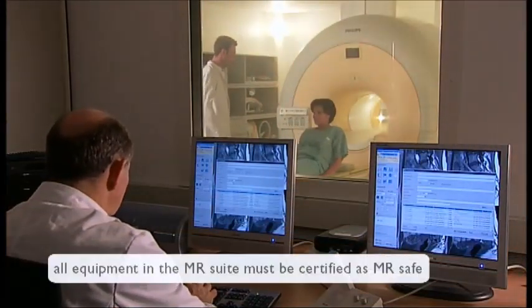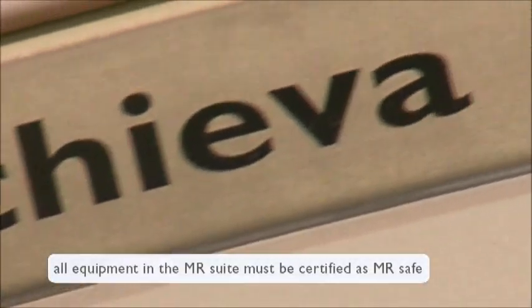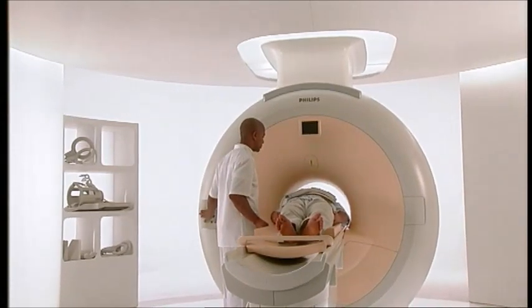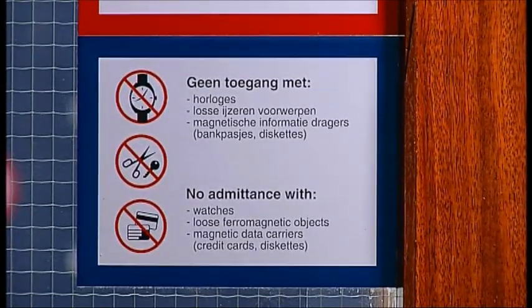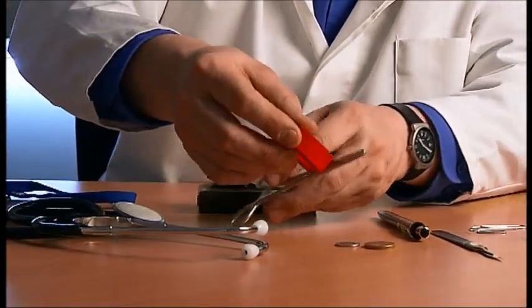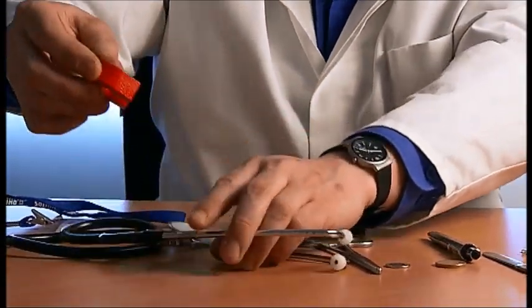Note that equipment or tools which have been approved for use with magnets of up to 1.5 Tesla may no longer be suitable for use at 3 Tesla because of the higher forces at this field strength. Some common items that must never be taken into the MRI scan room include pulse oximeters, clipboards, stethoscopes, scissors, pagers, and pens.